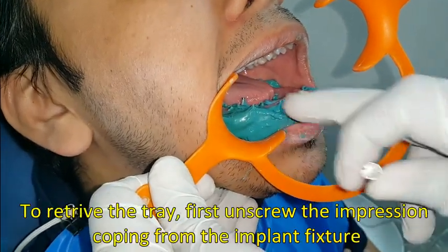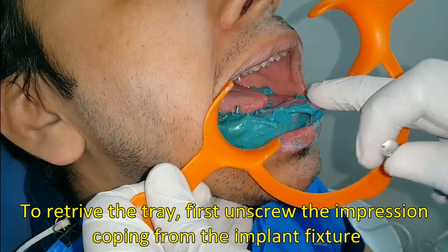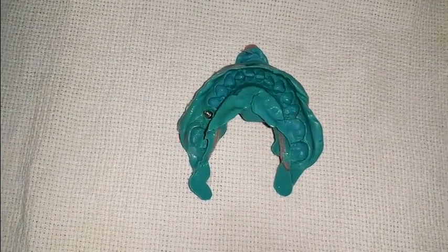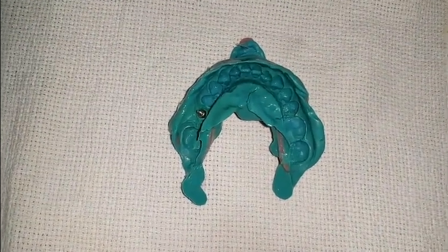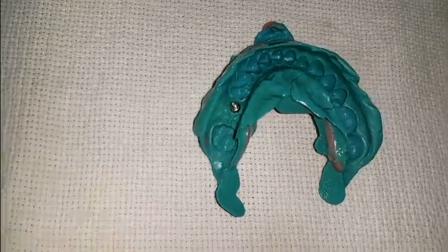Now our impression material is set. This is our impression where you can see everything is recorded very well, especially the impression coping and the area around the impression coping.